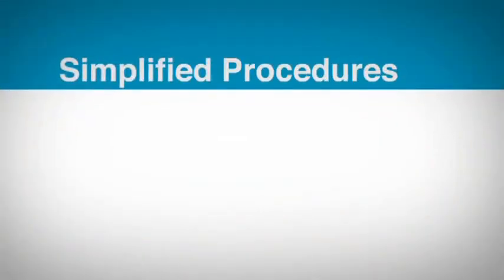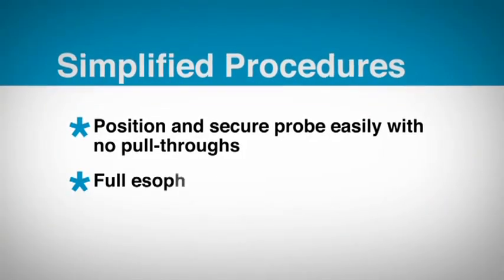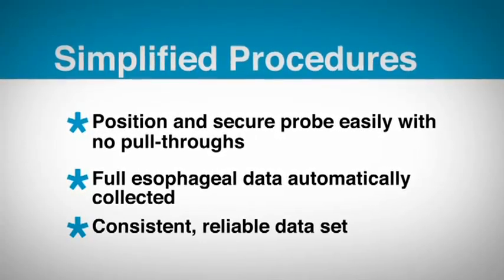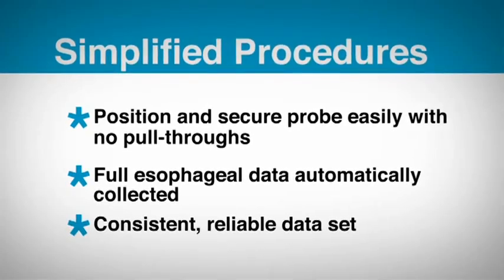Manoscan means simplified clinical procedures. For esophageal manometry, simply place a probe in the esophagus, allow a brief acclimation period, record swallows, and you're done. The full esophageal data are automatically collected.